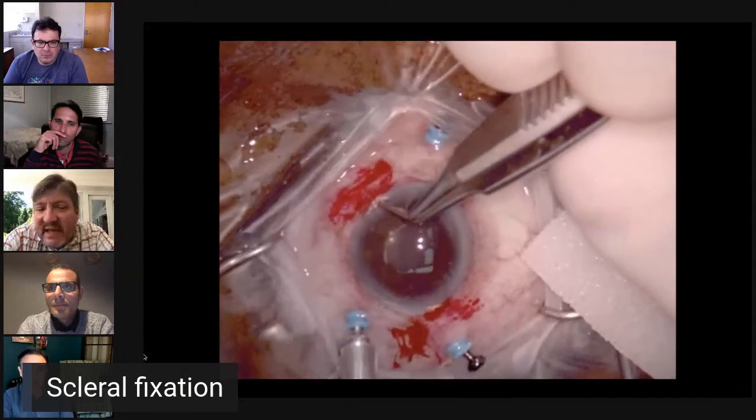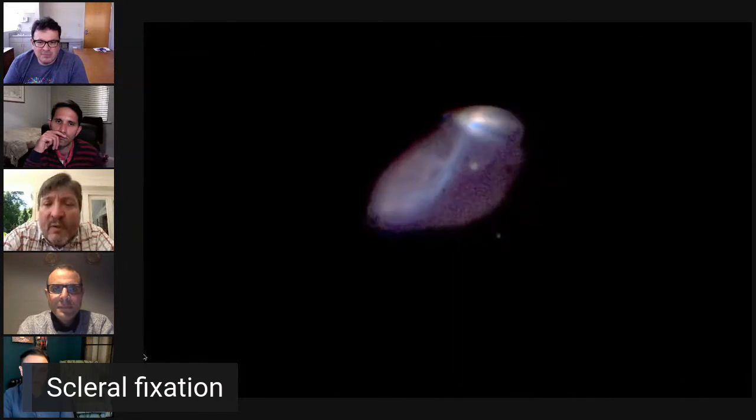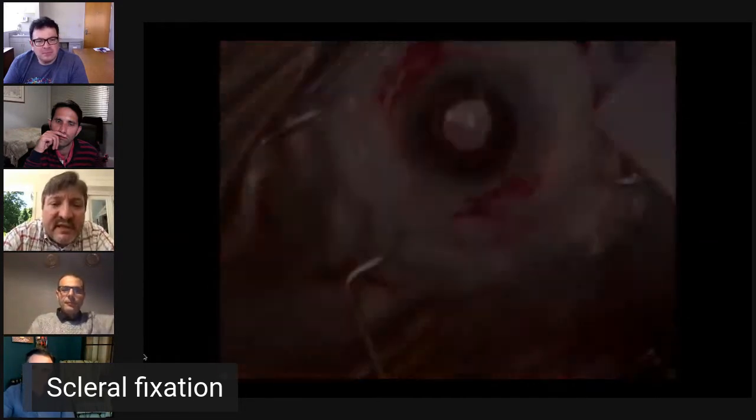This is really sexy. It worked really well for this patient. I don't do this except for in extreme cases anymore. You know, it was nice to be able to use a foldable lens and not to have the big wound. The patient didn't get a suprachoroidal hemorrhage, and that was a nice way to do it.